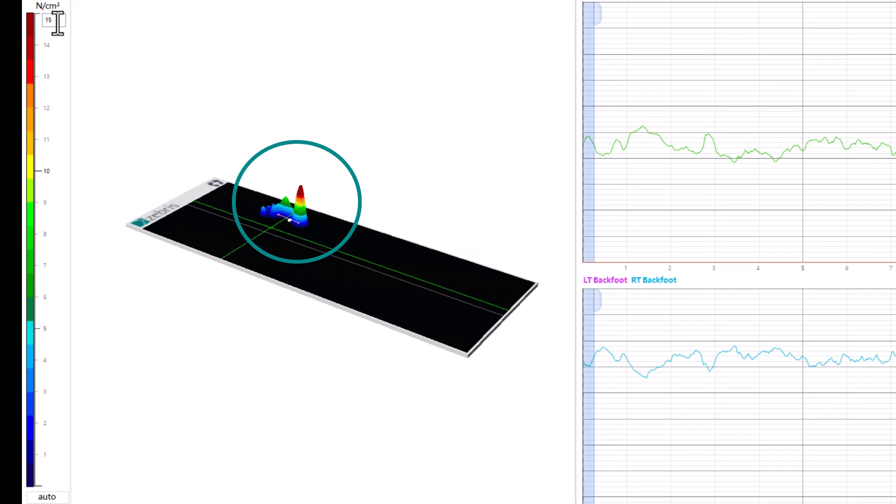Secondly, it is now also possible to automatically adjust the pressure scale to the maximum pressure within the analysis interval at the push of a button. To do this, simply click on the Auto button below the pressure scale.